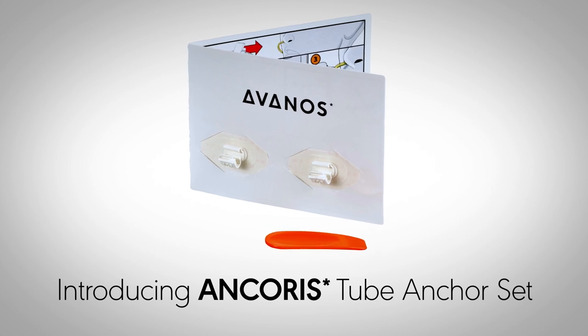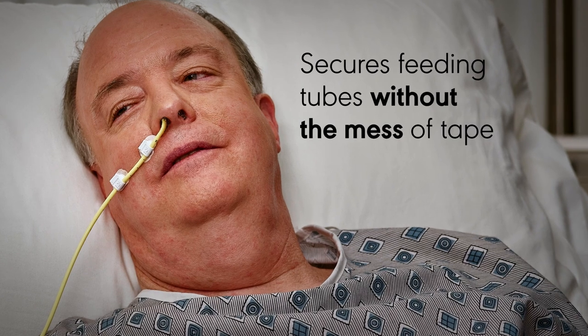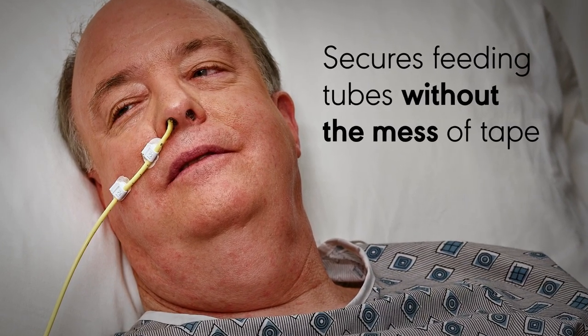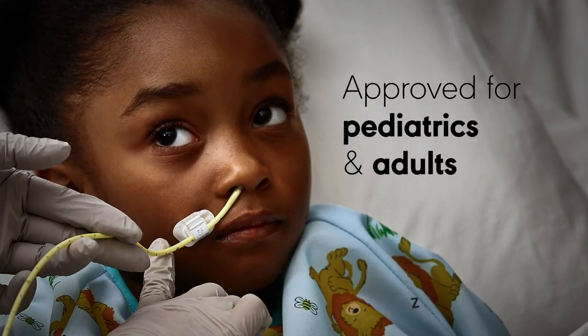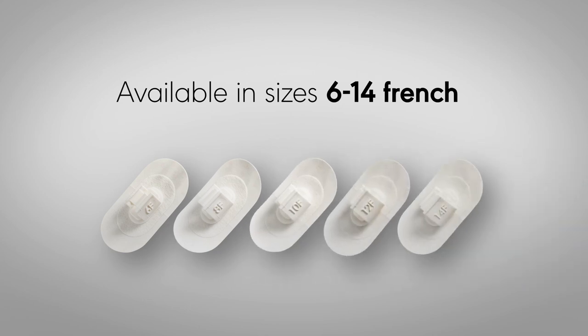The ANCORIS Tube Anchor Set is a pair of clamps with an extended wear adhesive that are designed to keep feeding tube secure without the mess of tape. The device is approved for use on pediatrics and adults and is available in sizes 6-14 French.